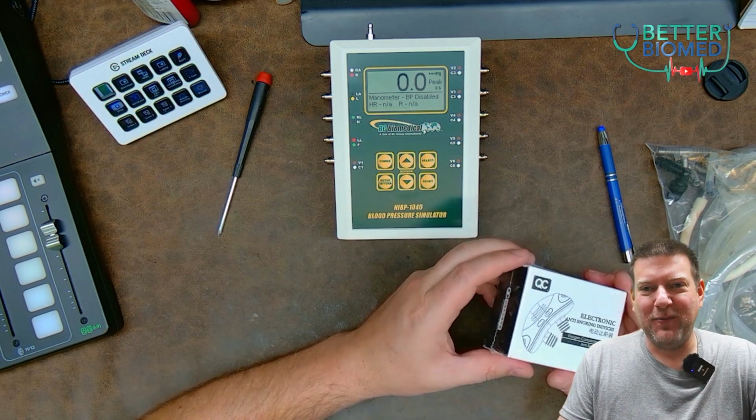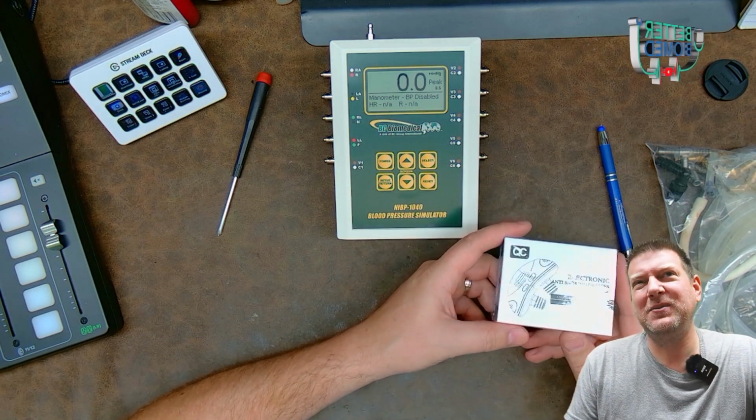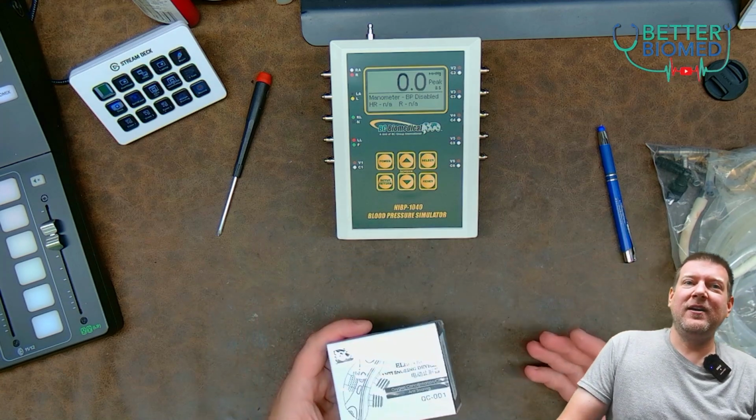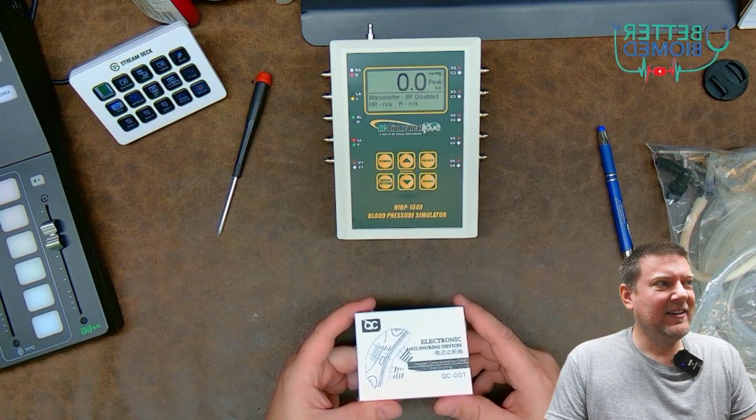Today, I've got a really unique device. Found it in my local Goodwill. I love going to Goodwill because they either have broken stuff, which I love going through, or they have unique things that I've never seen before. And this just kind of takes the cake.